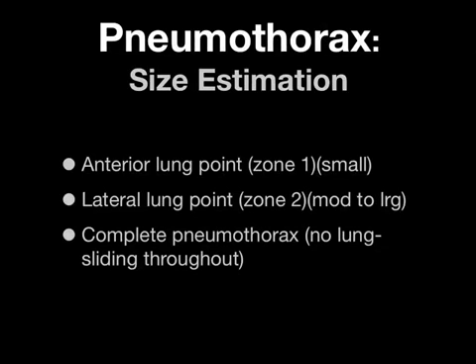Ultimately, this test should be of great clinical use to you. You want it to be more than just a nice toy to say, boy, there's a pneumothorax present, but I don't know what to do with it. So as you become more proficient with this thoracic exam, you want to make sure that you can develop the skills necessary to estimate size.